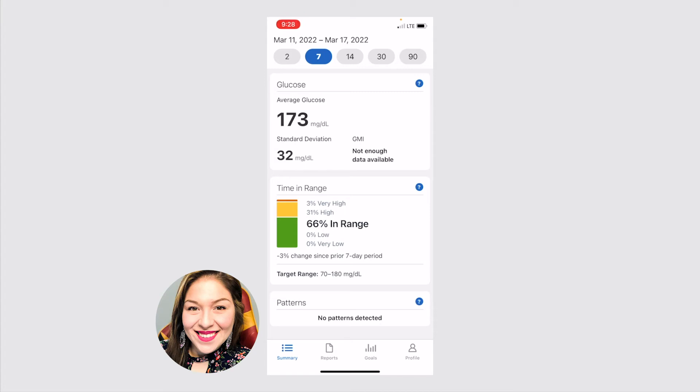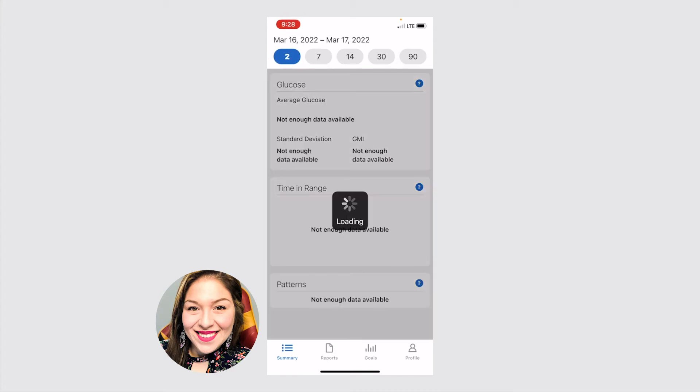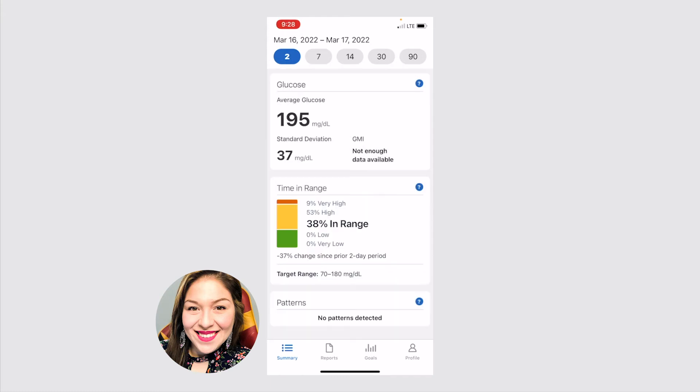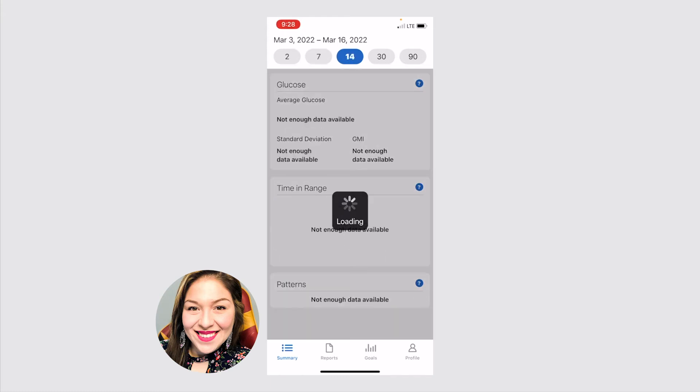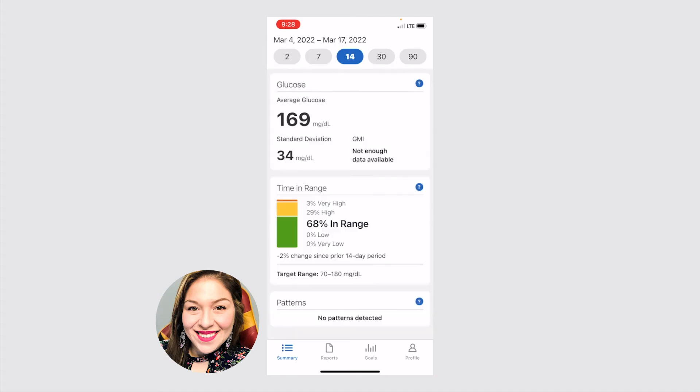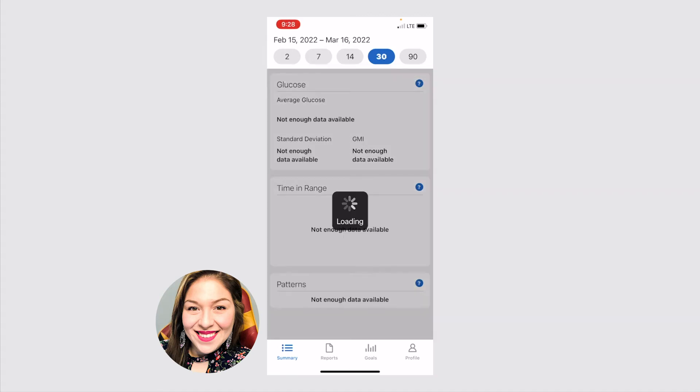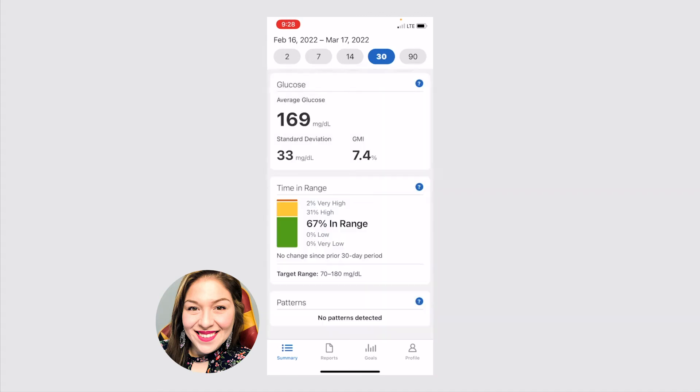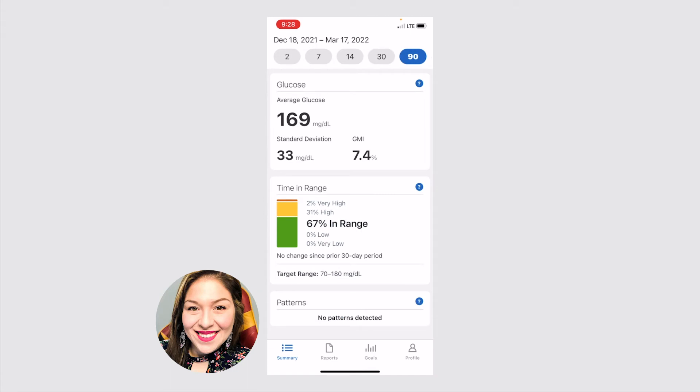It'll show you two days, what your sugars have been, seven days, 14, 30, and 90.